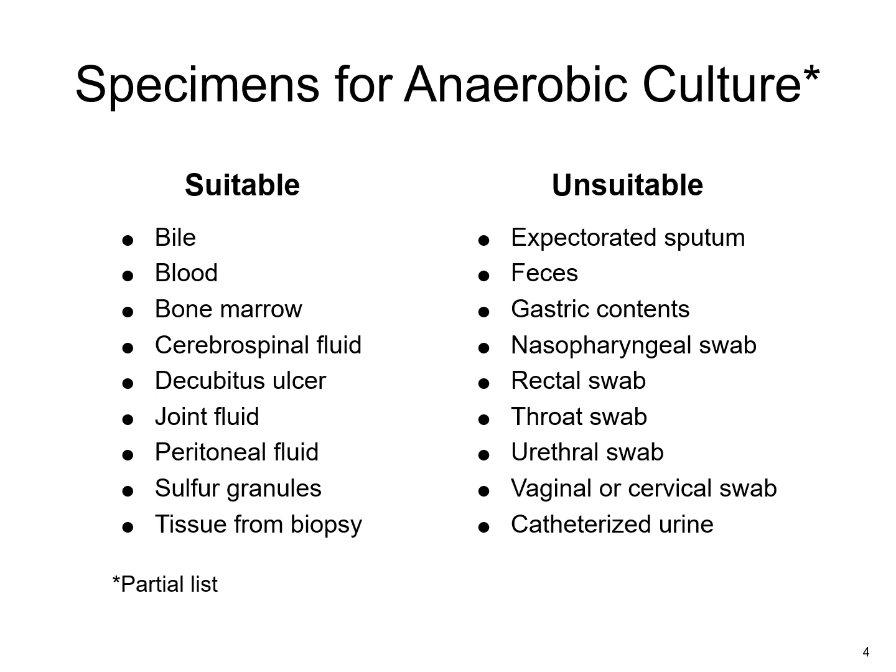As far as unsuitable specimens, we know that anaerobic organisms can die within a few minutes once they're exposed to air. So obviously any culture that would be collected with exposure to air would be unsuitable, because those organisms would not survive very long once they're exposed to air.